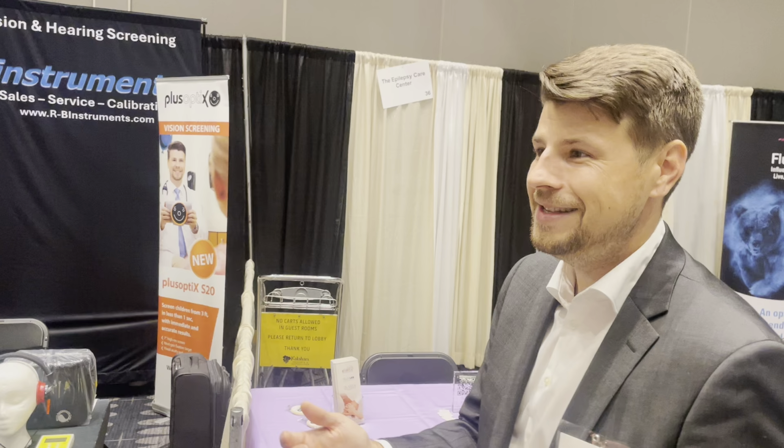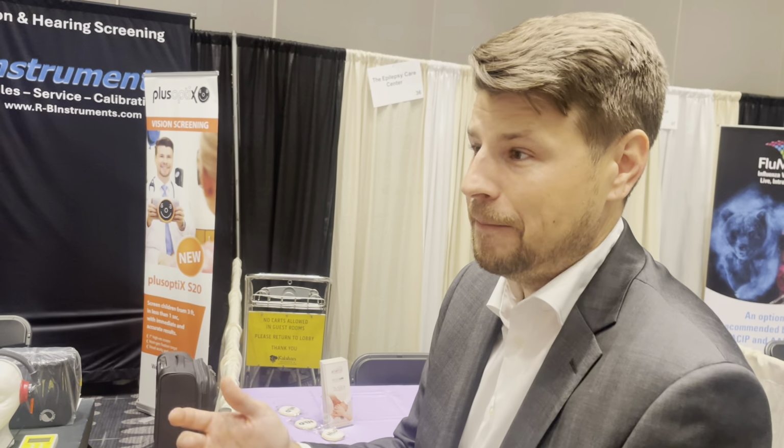After that, they do nothing for a long time, and then at age 4, they sometimes attempt visual acuity testing, which is a wall chart, and you cover one eye, you're at either 10 or 20 feet away. Cover one eye, you read it, you cover the other eye and read the same line, same letters. So there's a lot of room for error. There's room for cheating when they peek through their fingers, and there is room for error because of the distance. If it's not the exact distance, the whole calibration of the wall chart is for nothing.